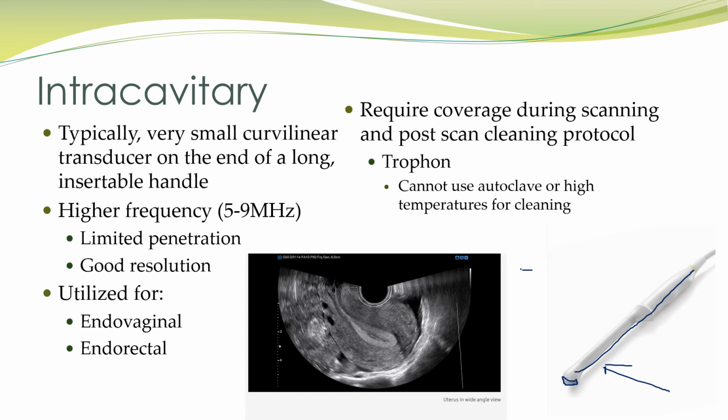One of the purposes of that is once you insert this transvaginal transducer, if there were to be something large off of an ovary or maybe off of the fundus of the uterus, this transducer would not necessarily have the penetrative ability to demonstrate that problem. And so by adding a transabdominal prior to doing a transvaginal, we're taking more of a global look to hopefully not miss anything big that we would miss by this up close view that we do with the transvaginal.